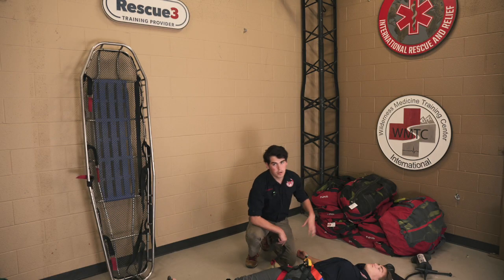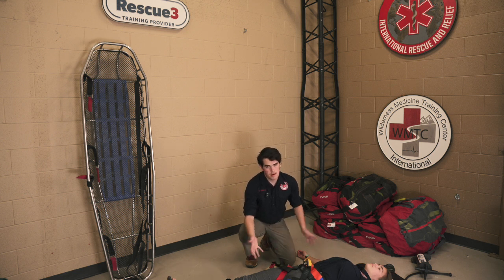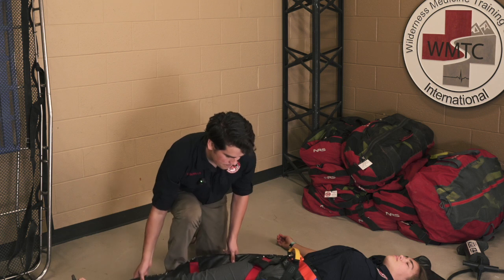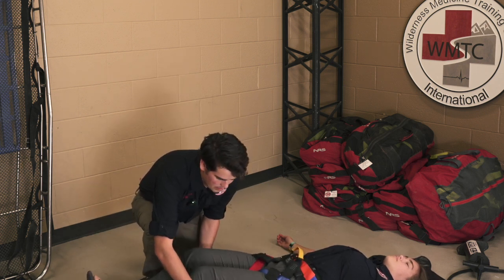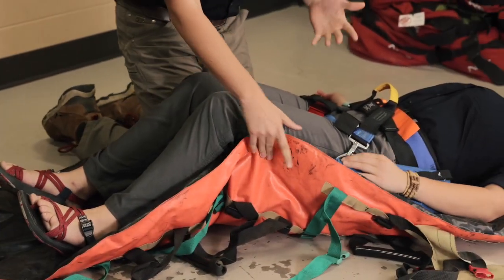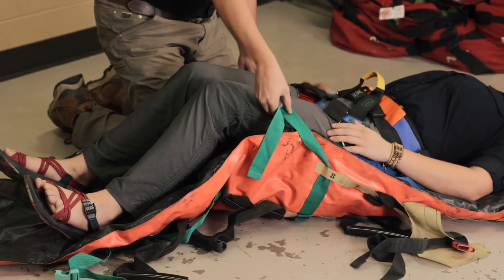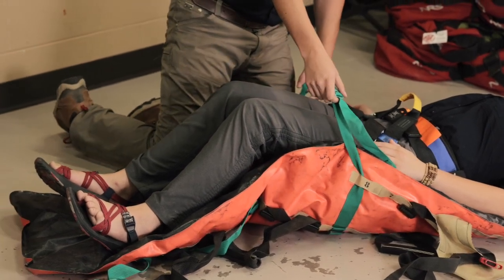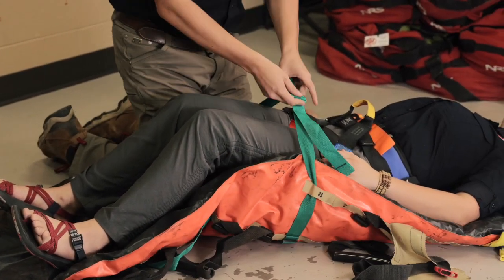The next step is to get the patient settled into the vac mat. Depending on environmental conditions, if you feel it's necessary, you can package your patient into a life blanket before doing this. Have the patient bend their legs a little bit — you may need someone else to hold it or place something on their legs. Then start clipping these buckles together. All the buckles are also color coordinated, which makes it easy to see what goes where.